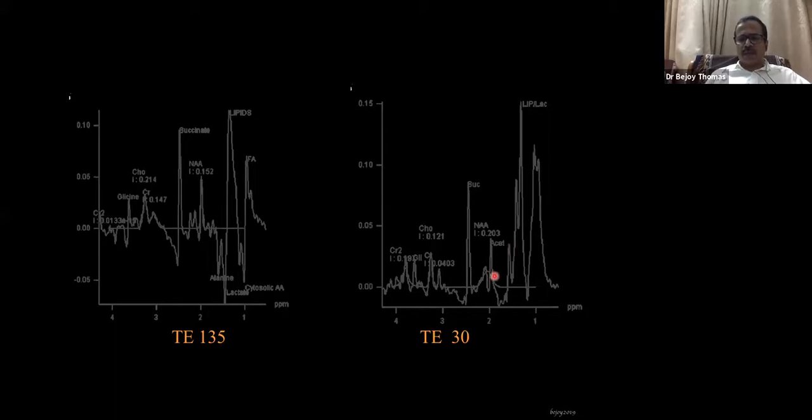Then at 1.92, this is the NAA peak. Don't get misled, because the machine will automatically label it as NAA, whatever it is. So you should actually see which is at 2 and which is at 1.9. At 1.9, you see an acetate peak. So you see an alanine peak and an acetate peak. At 2.4, you see a large peak, which is the succinate peak. So we are seeing a lot of peaks.